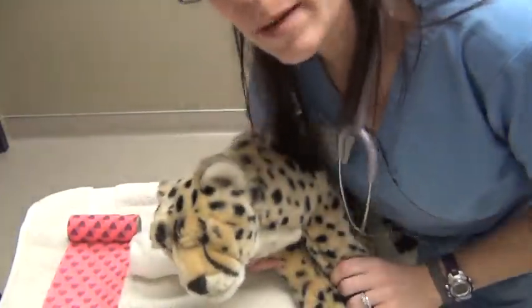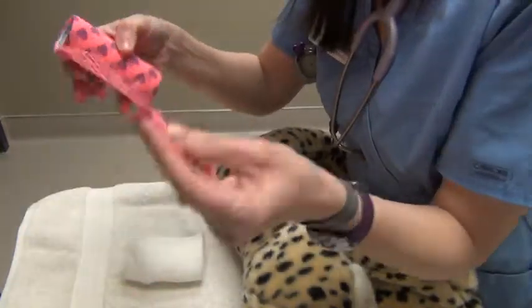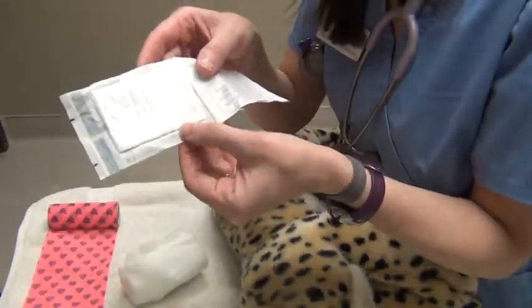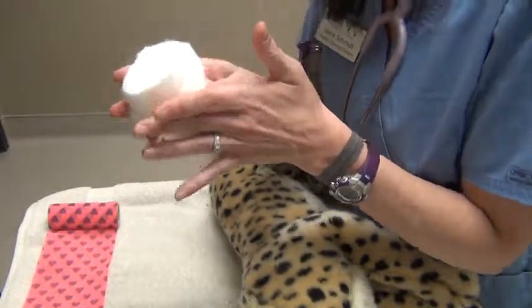Hey, it's Leslie Schmidt. I'm going to be applying a simple abdominal bandage to my patient Nutmeg here today. I've got the supplies I need, which will be vet wrap for my outer layer, my tertiary layer. I've got a Telfa pad for my primary layer in case I have a wound, I don't want anything sticking to it. And then my secondary layer is going to be some cast padding.